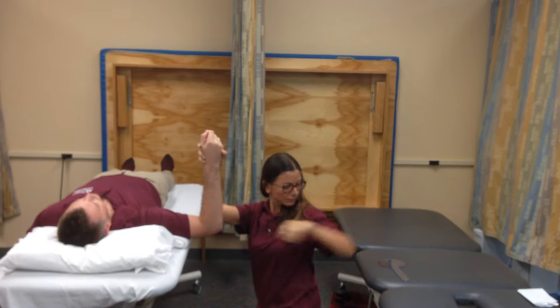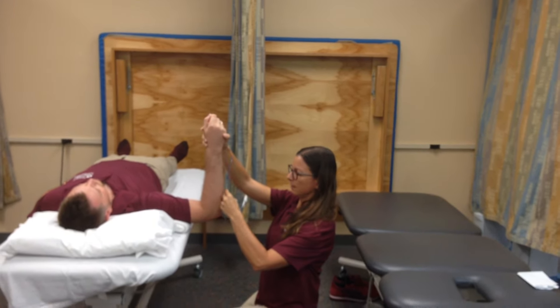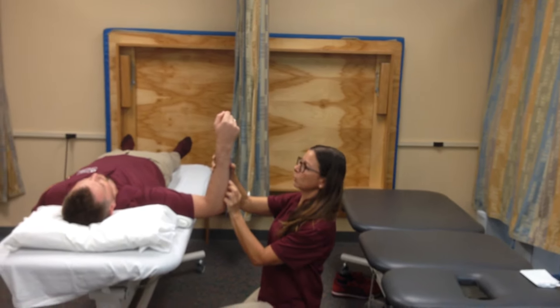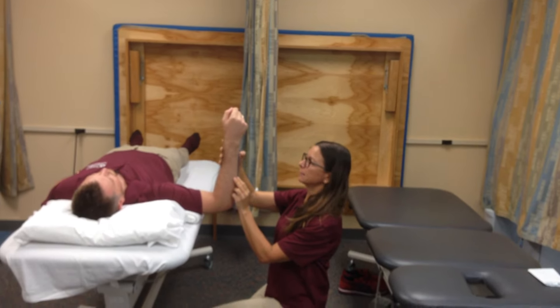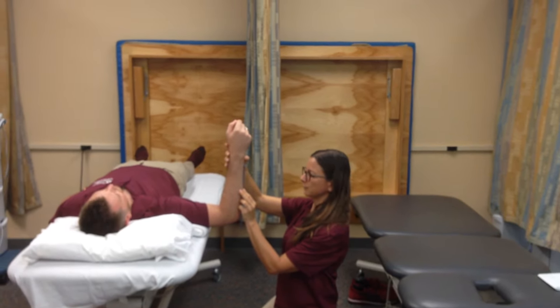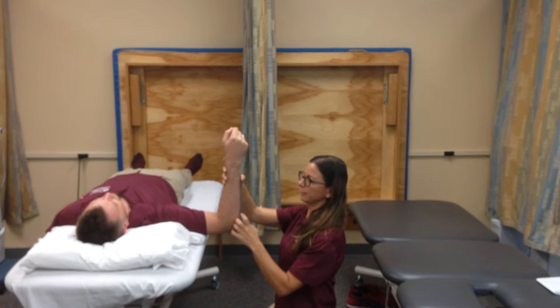Next, I'm going to take the goniometer and align it with the anatomical landmark. The fulcrum is placed at the olecranon process. The proximal arm is supposed to be perpendicular to the floor and the distal arm aligned to the ulna using the ulnar styloid process. I'll measure it — it's going to be zero degrees.